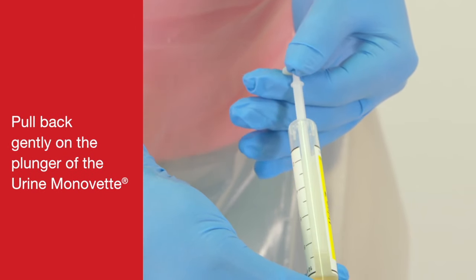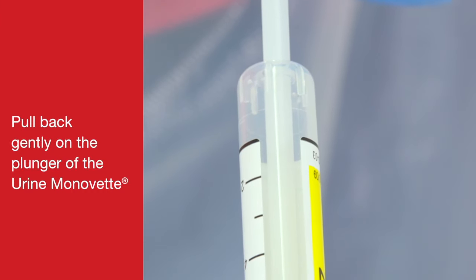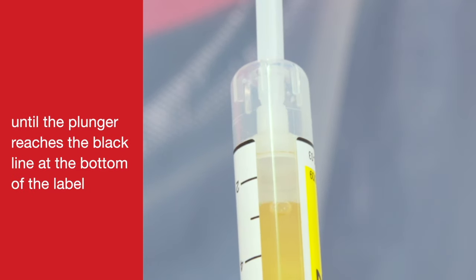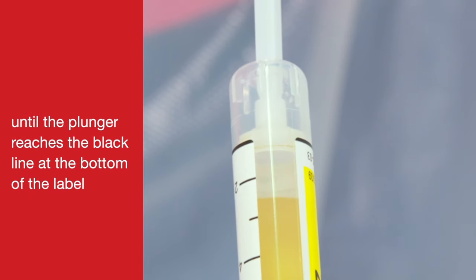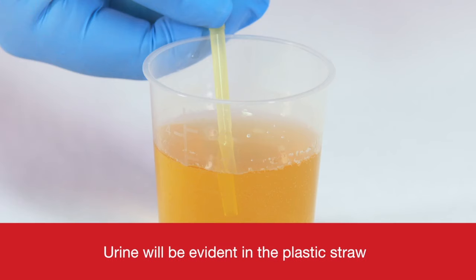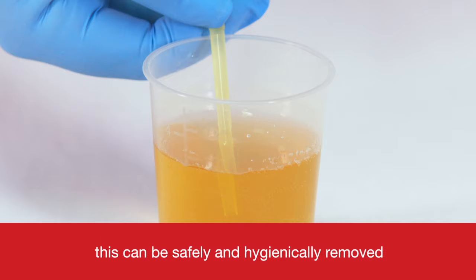Pull back gently on the plunger of the Urine Monovette until the plunger reaches the black line at the bottom of the label. Urine will be evident in the plastic straw. This can be safely and hygienically removed.